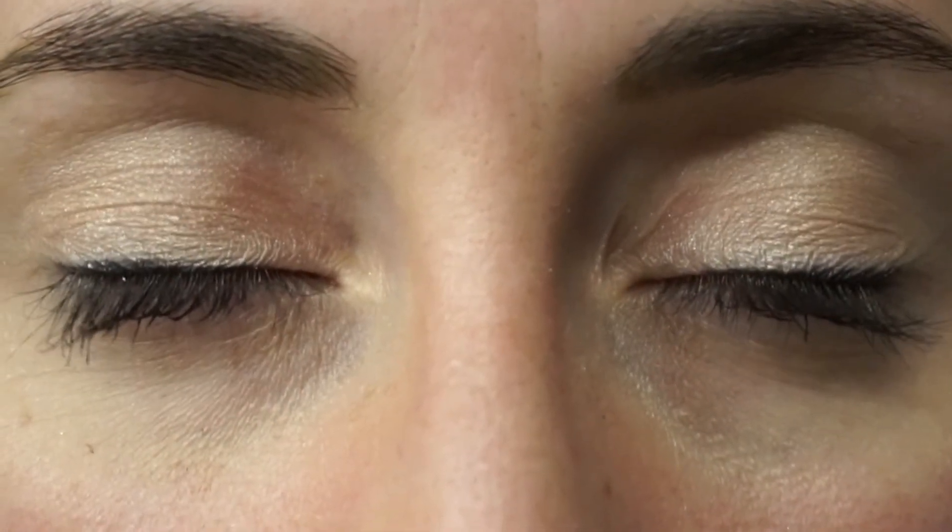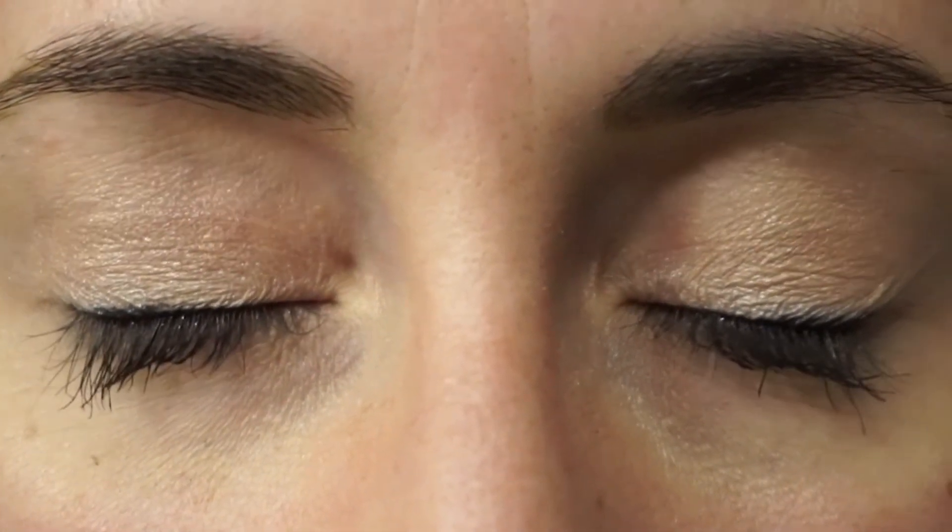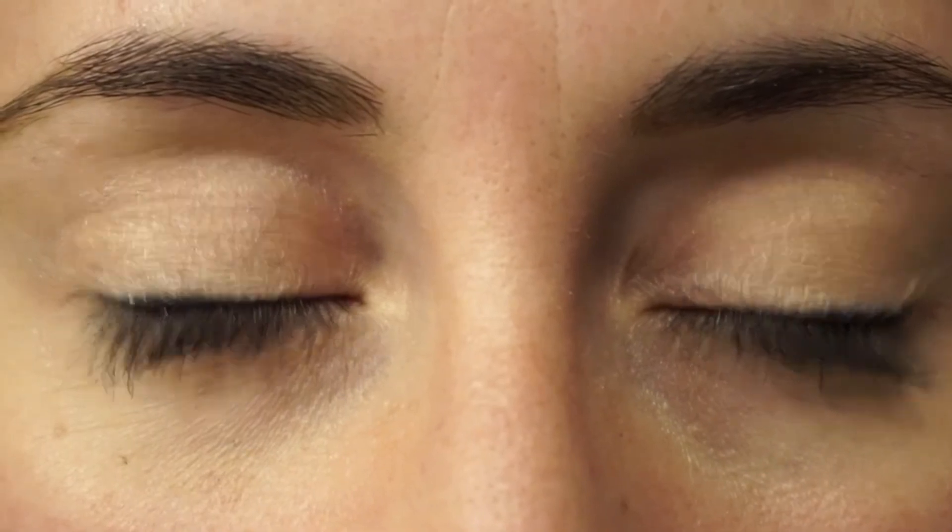Step 8: Release one eyelid, then the other eyelid, but not both at the same time. From there, gently close your eyes and slowly move them around. This allows for your contact lens to settle.